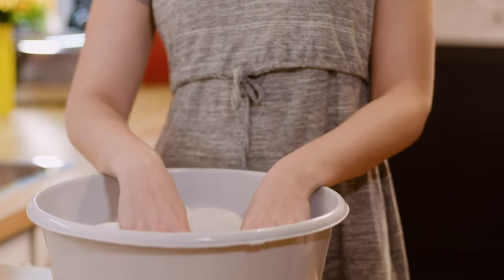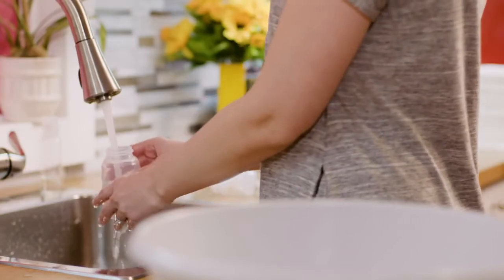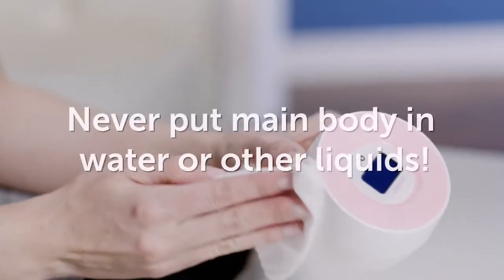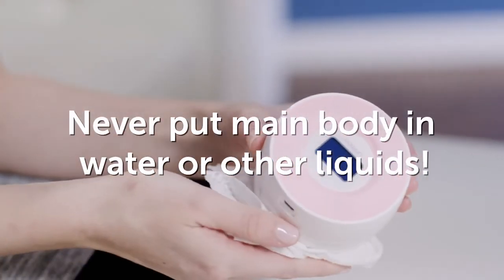Then clean these parts as soon after pumping as possible, either in a dishwasher or by hand in a wash basin used only for cleaning the pump kit and infant feeding items. Remember, the main body should never be put into water or other liquids for cleaning.